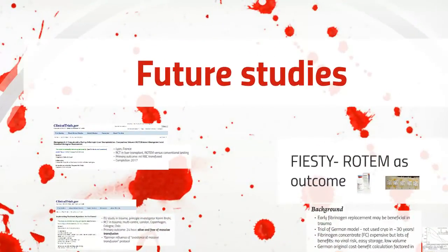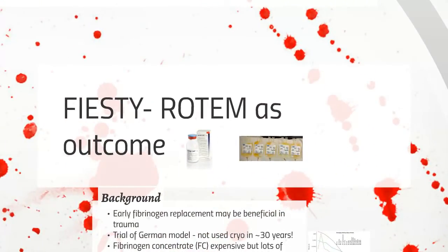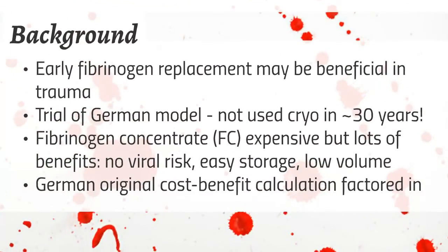Now, I've got 5 minutes to go over the remaining future studies. So this is a really interesting one, partly because it has a catchy name, Feisty. This is happening up in Queensland, and it's essentially a trial of the German model. It's giving either cryo or fibrinogen concentrate to trauma patients, but basing it on their ROTEM.